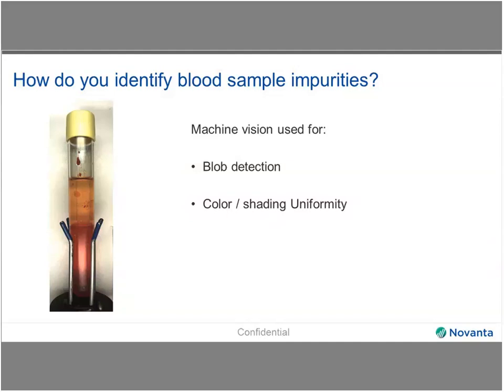As you can see on this particular sample, we have some impurities both in the upper area on the wall and also within the serum area. The issue with these impurities is that if a pipette is sent down into the tube to retrieve serum samples from the serum area, and it happens to retrieve a serum sample from an area where a clot is, it could very well throw off the results of the testing, the follow-on testing.